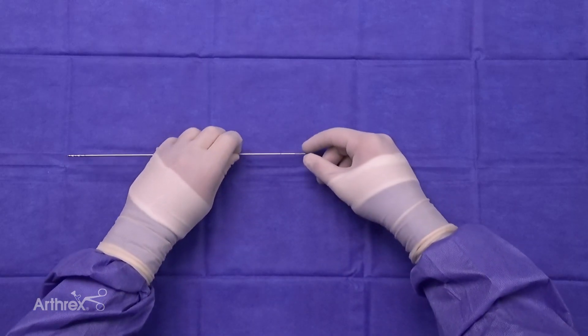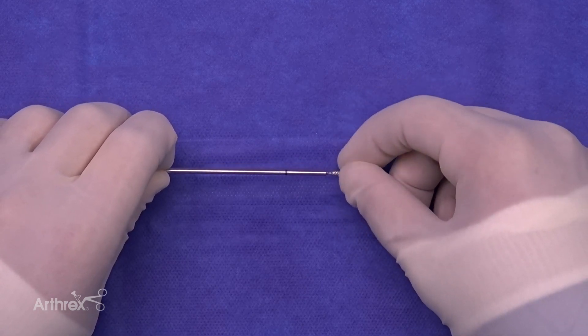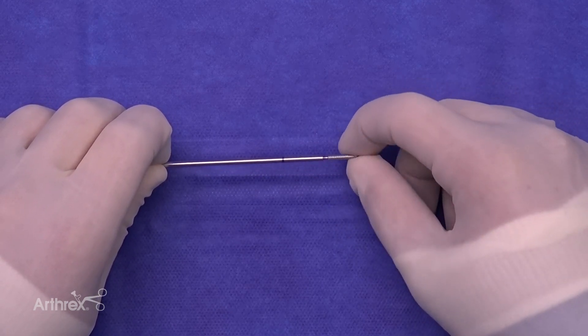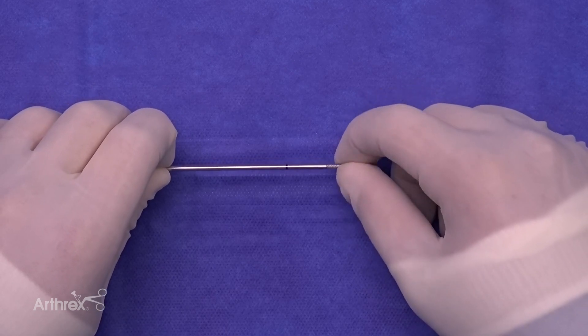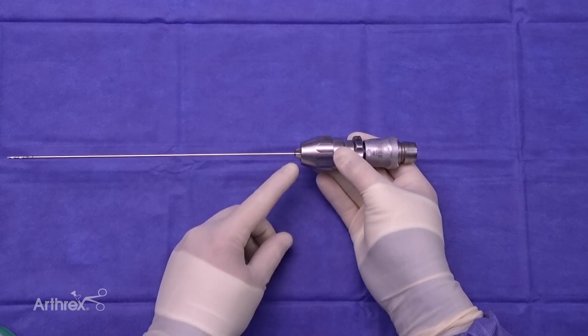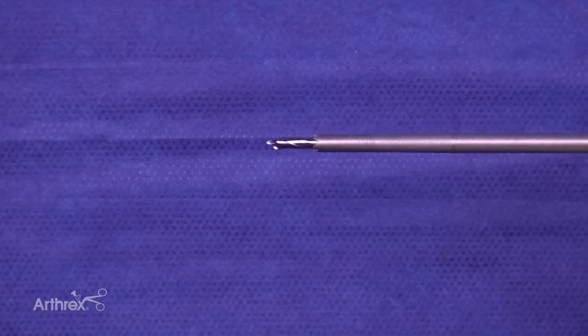Taking a closer look at the 2.4 drill, we can see it is a cannulated pin that threads into the drill in standard fashion. We chose a cannulated drill to facilitate passage of the nitinol wire, which is used to shuttle the internal brace through the tibia. Laser marks are placed at both ends of the drill so that when the guide is used, the depth stop will reflect 20mm.